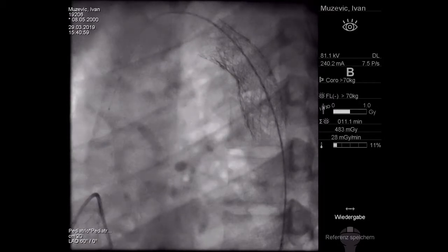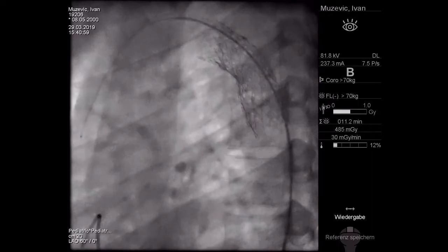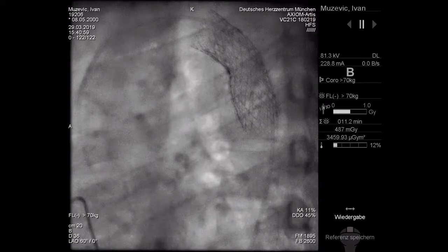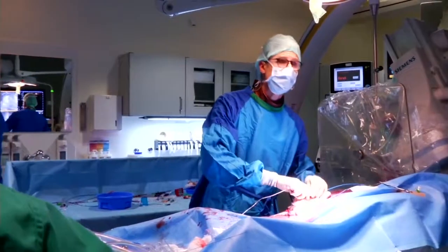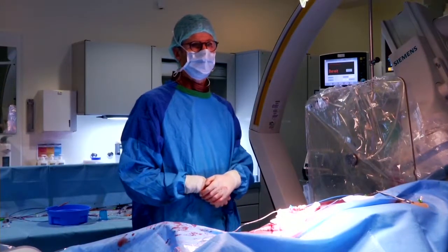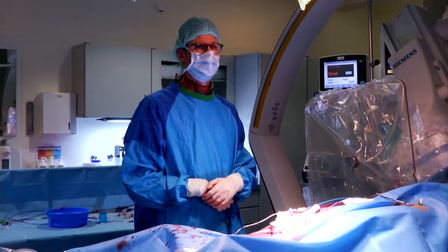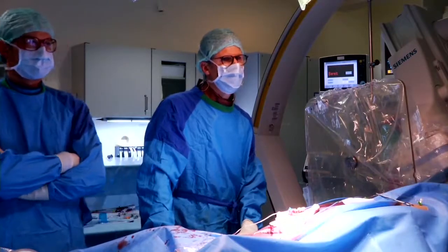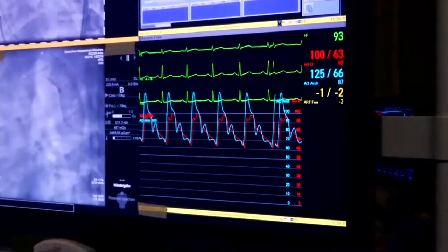Are you going to be doing the pressures now? Then we could look at that. We do this. Okay, so please flushing blue, and then we have blue against red. Red is the descending aorta, blue is the ascending aorta. Okay, let's have a look. Please show us the pressures. We can't see the pressure tracings at the moment. Okay, yeah, please, sorry. We have to twist it. So there's still a gradient of more than 20 millimeters of mercury. So, Jacques, what did I do wrong? Jacques?